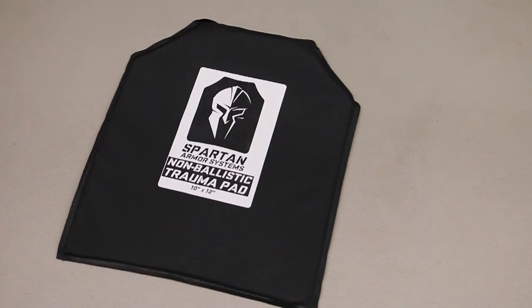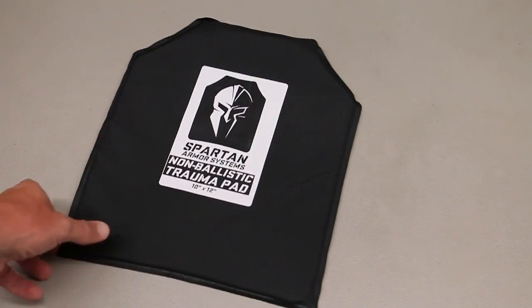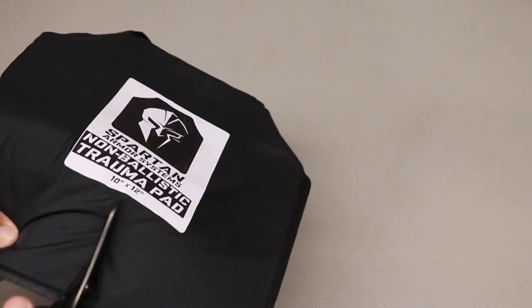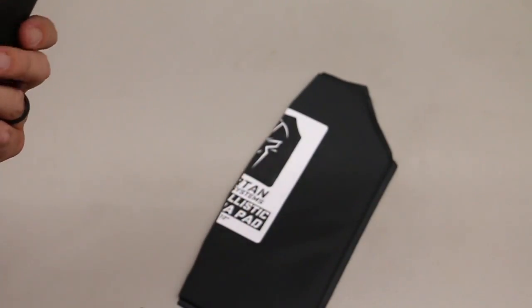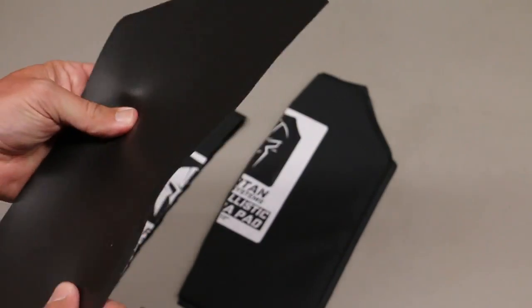You guys get really torqued when I start cutting things up, but hey, it's fun. I think it makes for a good video. So we have a trauma pad here. This is no ballistics, just a trauma pad here. So we'll take the XShears, cuts through really smooth. And now you get to see what's inside Spartan Armor trauma pad.